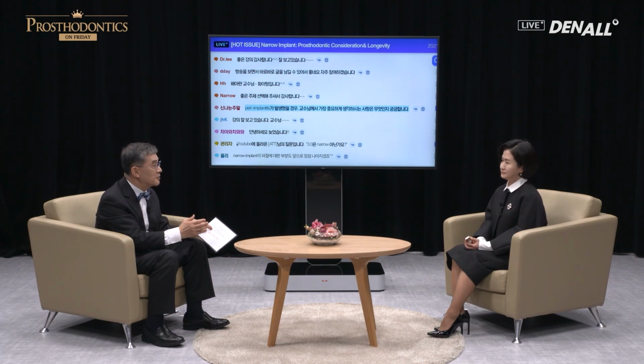Actually, the narrow diameter implants, I've talked about it today. We don't really have a lot of narrow diameter implant cases. Regarding narrow diameter implants, I have never experienced peri-implantitis at all. So I cannot really speak for how to resolve peri-implantitis for narrow diameter implants. From the top of my head, after placing a narrow diameter implant, peri-implantitis would not really occur when the distance between the adjacent teeth is proper. We talk about 30 degrees of emergence profile, but if we have a 45 degrees emergence profile, this can occur.